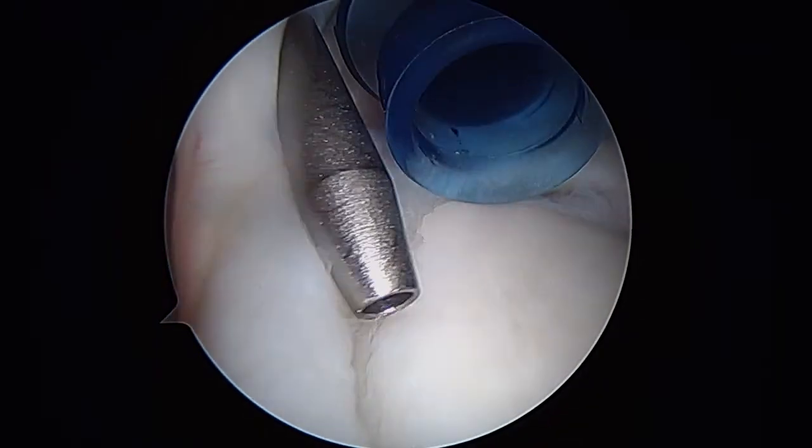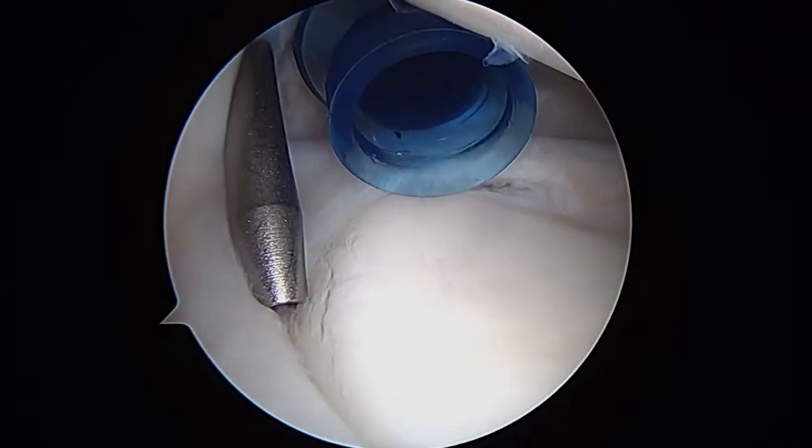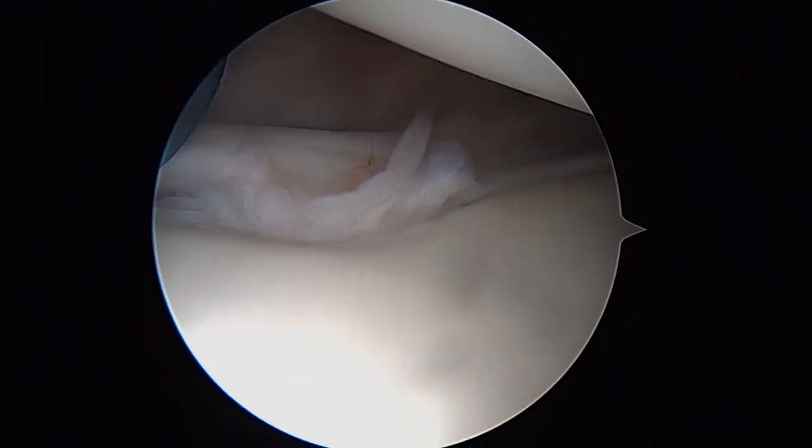So this is where we're going to be doing the SLAP lesion repair. That's usually the last thing we do when we're repairing an unstable shoulder, so you'll see that at the end. Now, we're going to go ahead and rotate the camera and look towards the front of the shoulder.